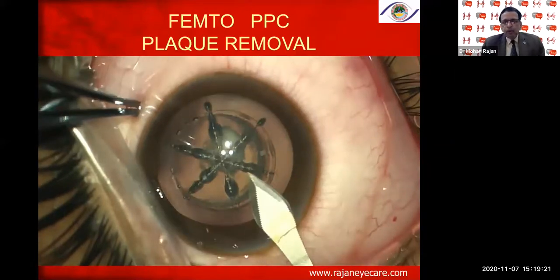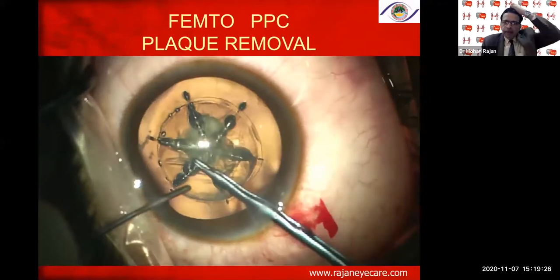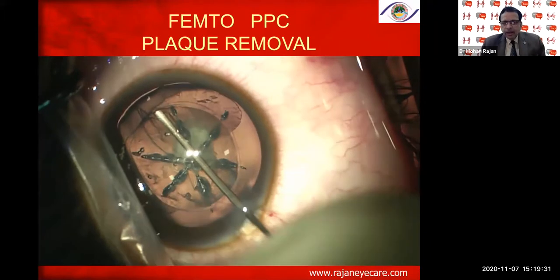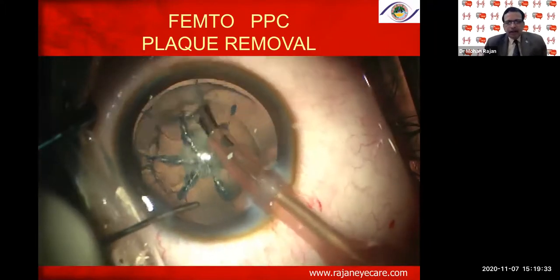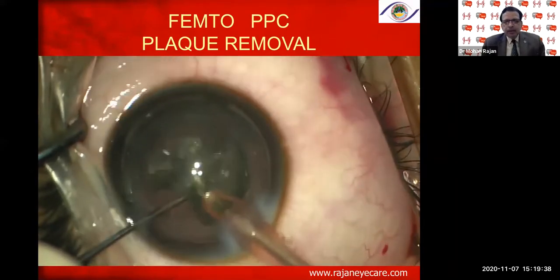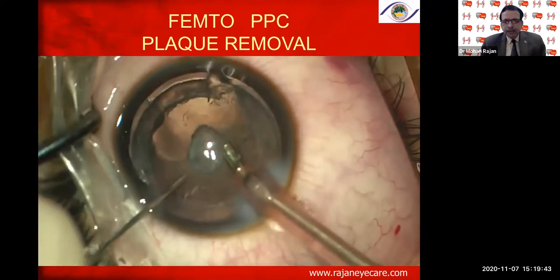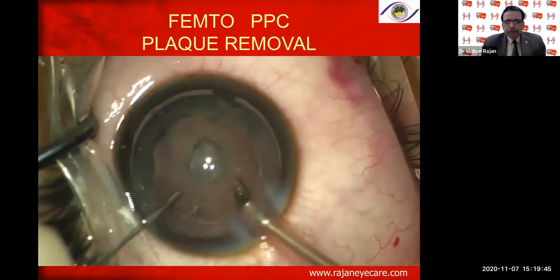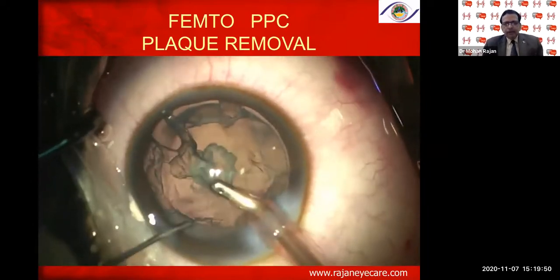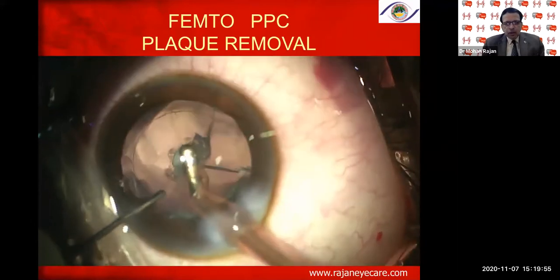Again, a FEMTO posterior polar cataract removal, wherein it's a young girl, and I've done only hydrodelineation, you can see here. The advantage of the FEMTO, the Catalys, is that it cuts the cataract into smaller pieces. You need to go in and just remove it. As I told you, the same protocols apply here also. Every time you come out of the eye, inject viscoelastic, whatever viscoelastic you have, whether it's HPMC, Hyalon, or Viscoat, whatever it is, then go ahead.